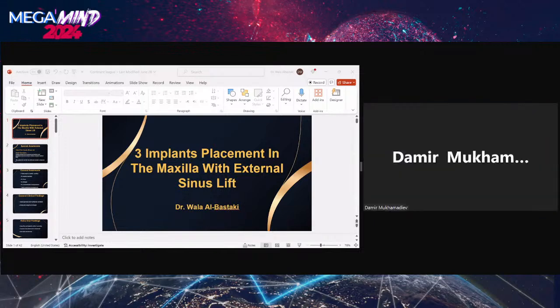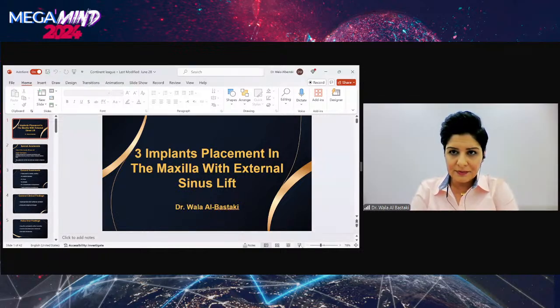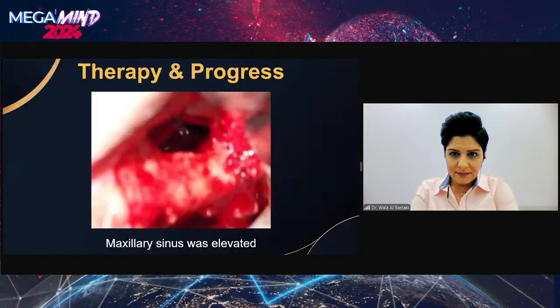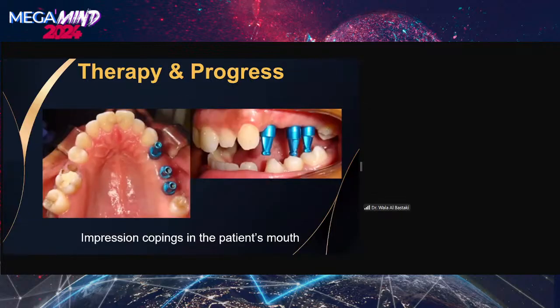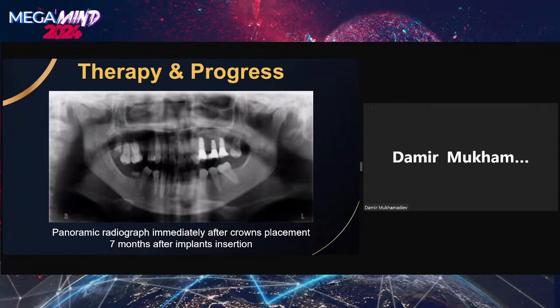If we go back to the postoperative OPG, can you show the OPG? Sure. This one? No, with the crowns. Yes, sure. Do you feel that I overgrafted the area? Yes, it looked like that. You can see here, it's a lot of material.